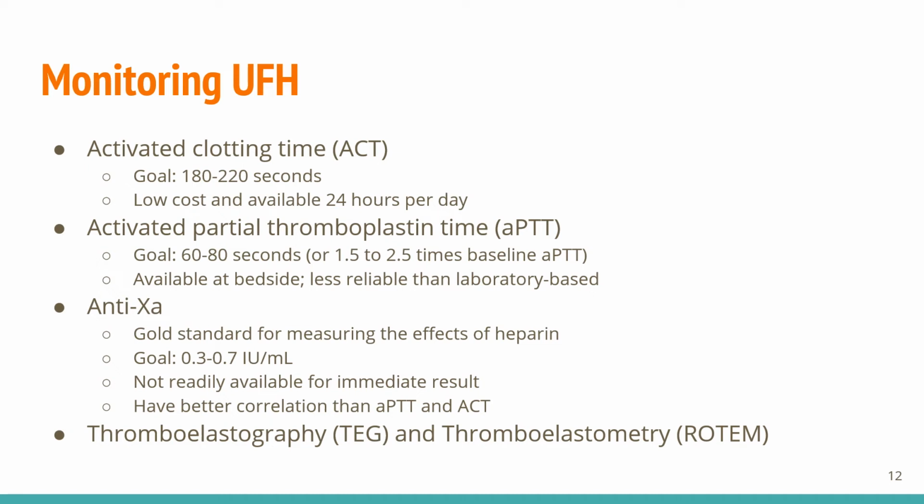And lastly, this assay might not be perfect due to its limitation that it can be affected by hyperlipidemia, hyperbilirubinemia, and high plasma-free hemoglobin level. This can happen especially often in patients who are critically ill and can falsely lower the anti-10A level.